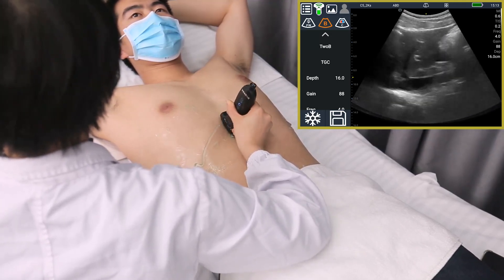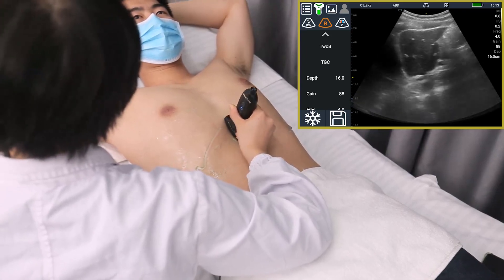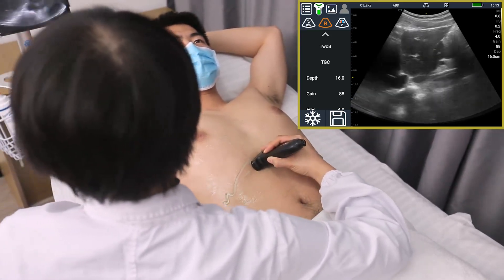Scan the longitudinal section of the liver to observe the upper and lower diameters and the anterior-posterior diameters of the left lobe of the liver, and whether the envelope is smooth.